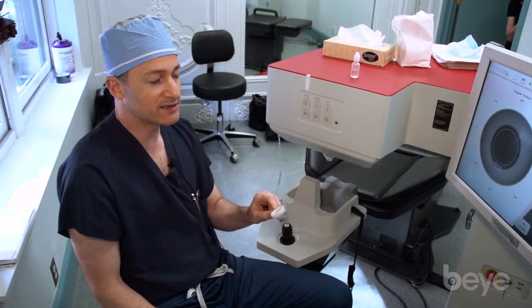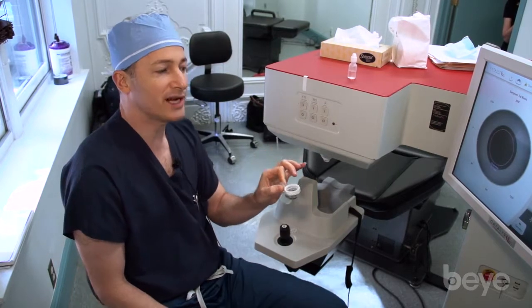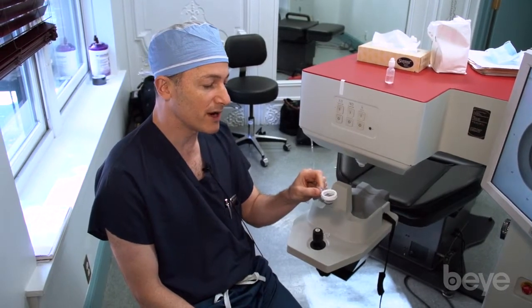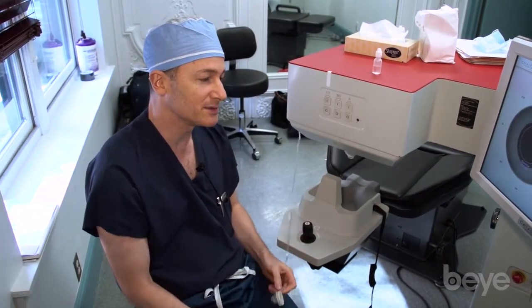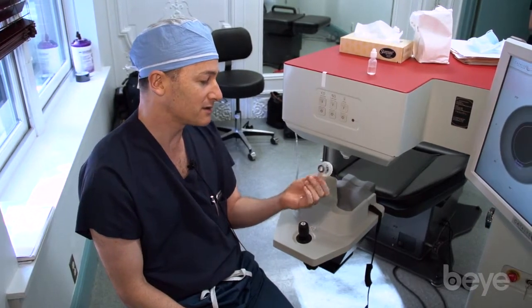The challenge with all these interfaces is that the softer and more gentle it is, the more chance there is for micro-movements to occur. We have to be wary of that, and sometimes micro-movements of the eye do occur. That's why femtosecond manufacturers have moved to faster capsulotomies and faster treatment times, so these small movements will have less of an impact on the surgery.